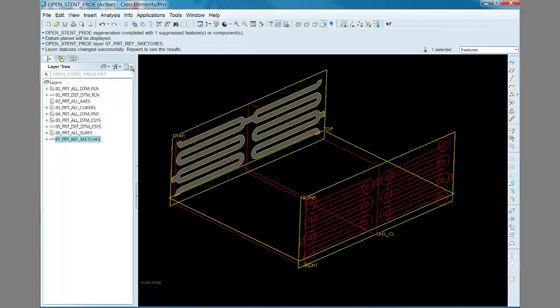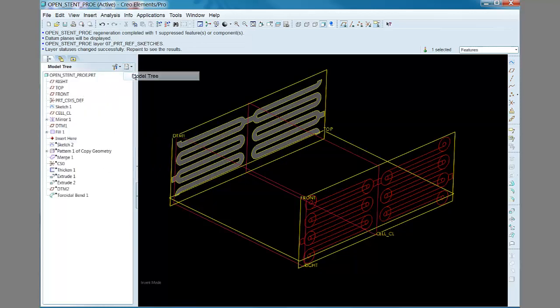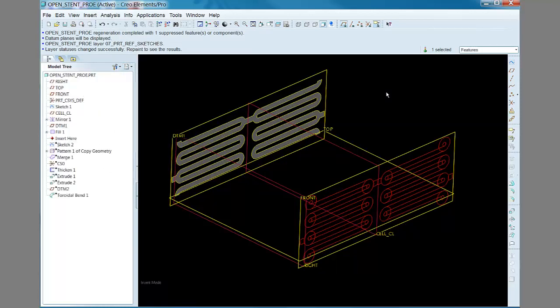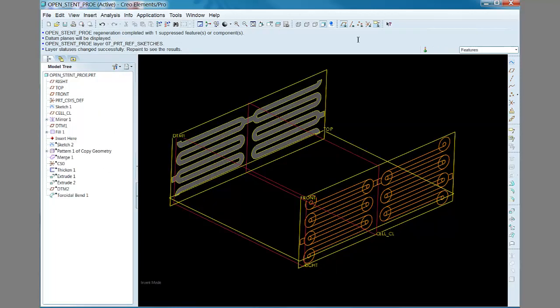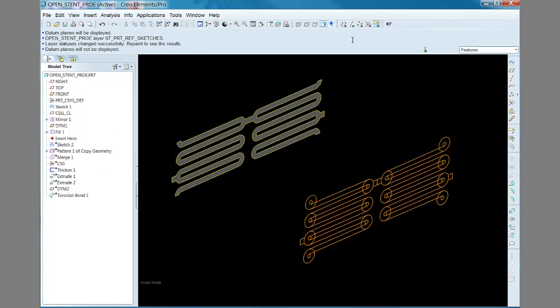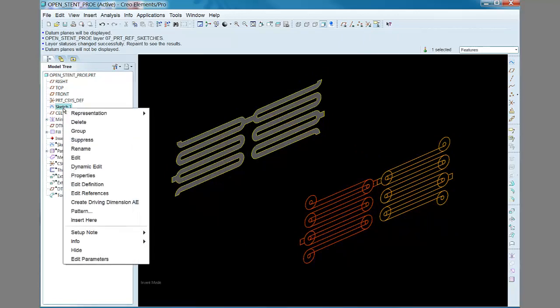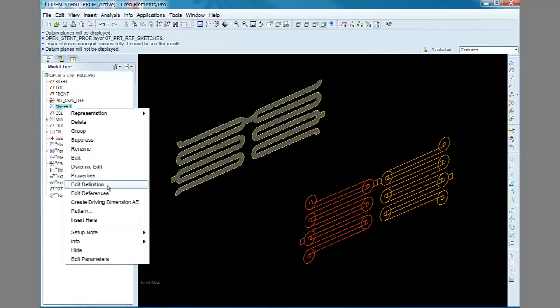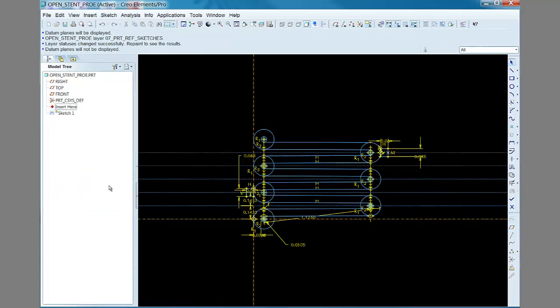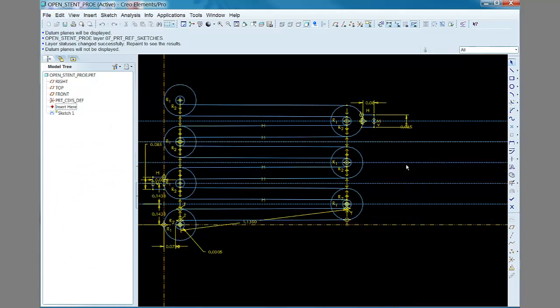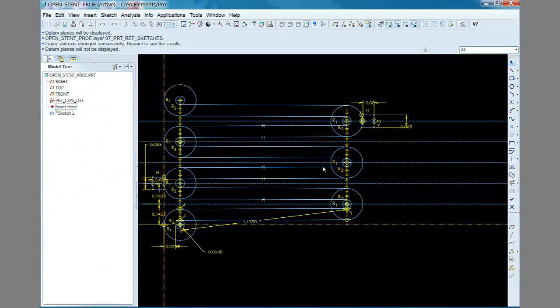But I originally found it easier to keep track of the unit cell dimensions using a separate sketch feature, in this case a separate datum curve. Here is a sketch of the original datum curve. This defines one half of the unit cell.